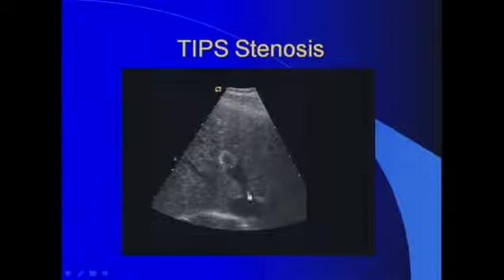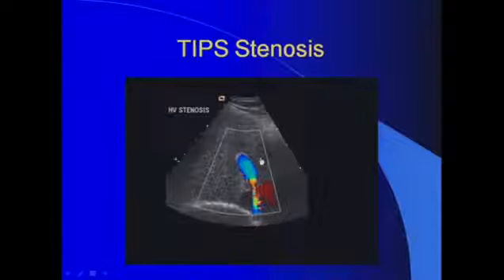In this example, as you see, it retracted all the way back into this hepatic vein, and this of course needs to be fixed. If you apply color Doppler, as we can see on the next example, you can see how nice flow is coming down the jet, and there's a jet phenomenon with aliasing coming through the narrowed segment of the hepatic vein where the stent retracted, suggesting that this is post-stent stenosis.